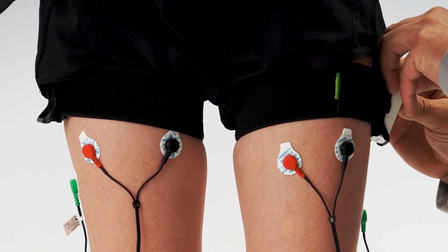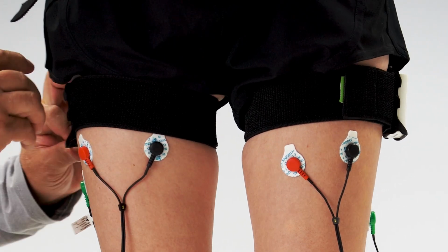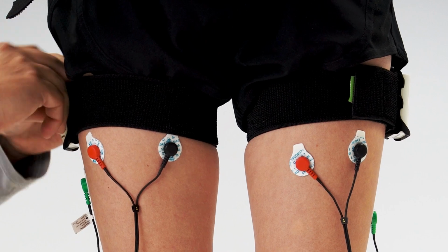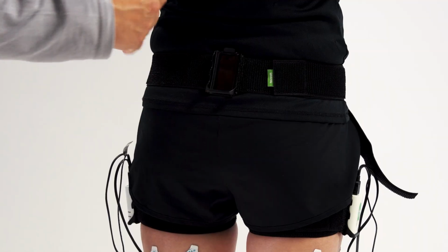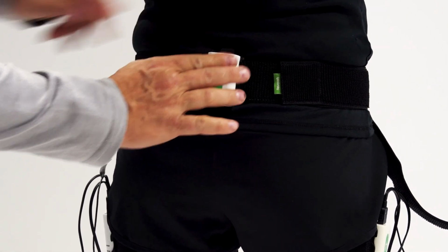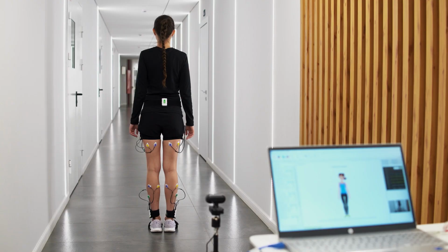Both movement parameters and EMG are recorded by a single compact device, Neurosense, the inertial miniature sensors that register speeds of rotations and acceleration along 3 axes, as well as an electromyogram along 2 channels. In total, up to 25 gait parameters can be registered. The sensors are wireless, powered by a battery, and transmit data to the program via Wi-Fi.